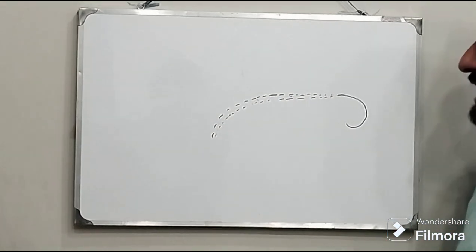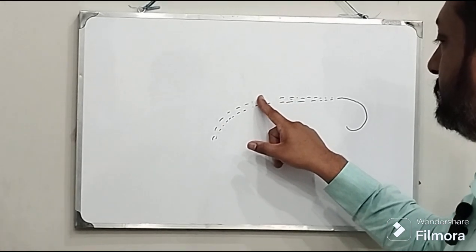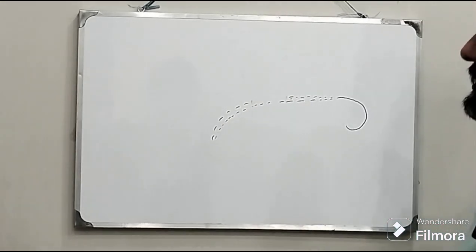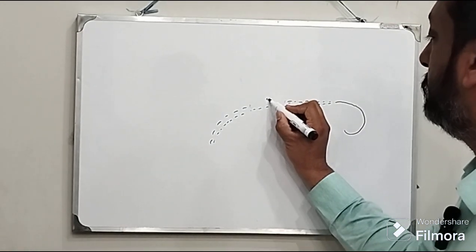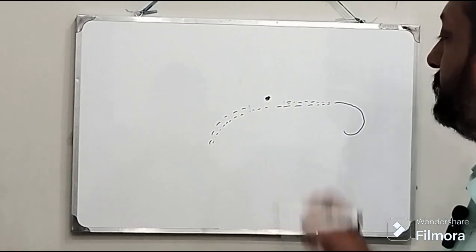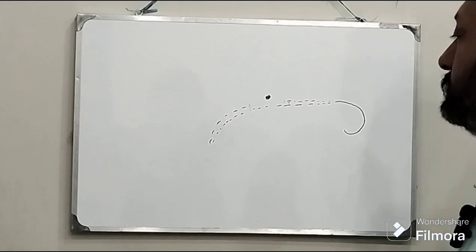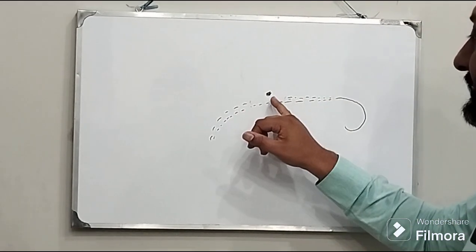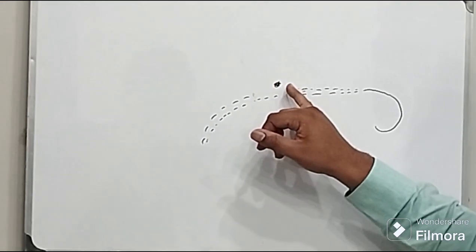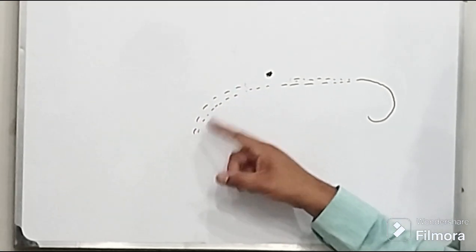And in the image where I showed you that there is a defect, this was the point from where the posterior elements were missing, almost upper lumbar level. And here an irregular shaped hyperechoic structure was present. This could be jumbled up bones, malformed bones, and this was the defect. So the double tram track appearance was disrupted at the point, and this was the point where the double tram track appearance was not clear. And further below, again the double tram track appearance was clear.